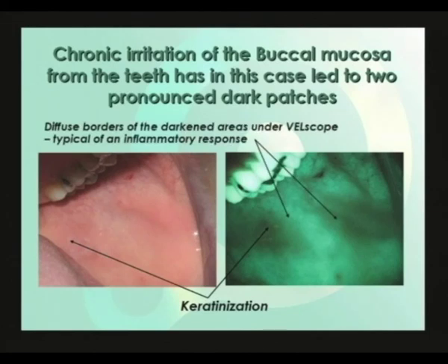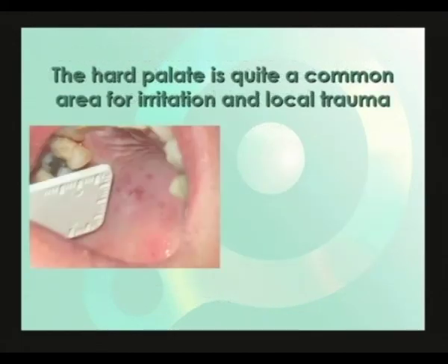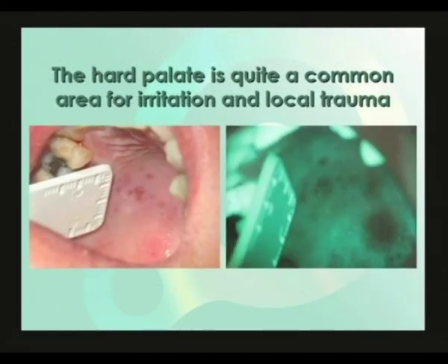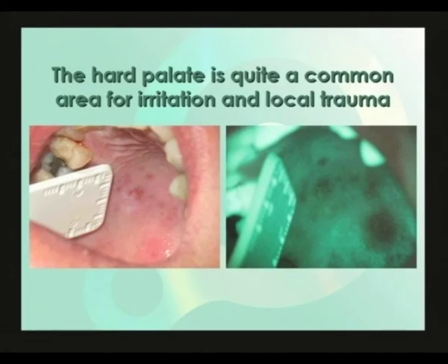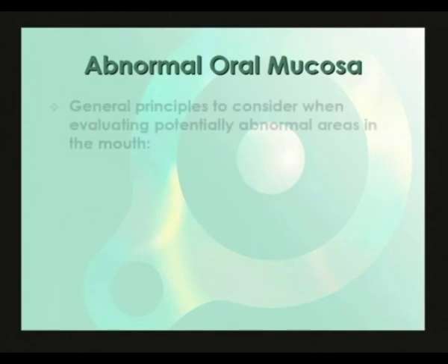This is an example of inflammation on the hard palate, quite a common area for irritation and local trauma. In this case the dark areas under VELscope correspond to the irritated and sore-looking areas under white light. The patient had been sucking on hard candies before coming to the dentist.